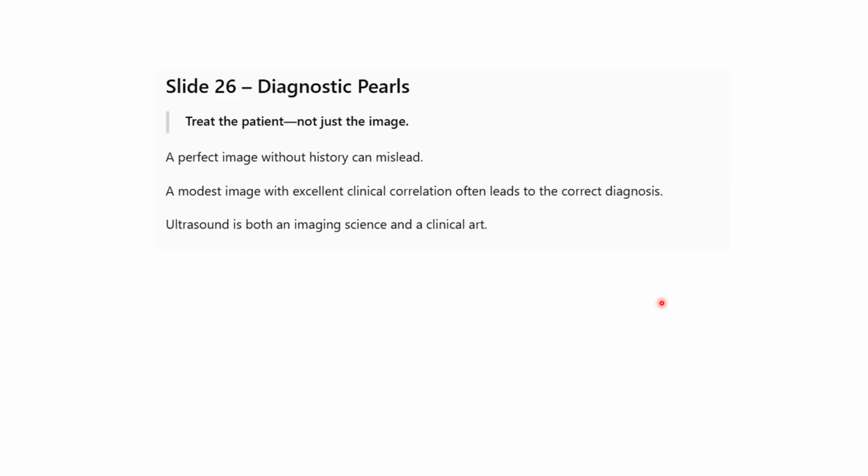These are the diagnostic pearls. Treat the patient, not just the image. So you're dealing with the patient, not just the image. A perfect image without history can mislead. A modest image with excellent clinical correlation often leads to the correct diagnosis. Ultrasound is both an imaging science and a clinical art. Take note of that.